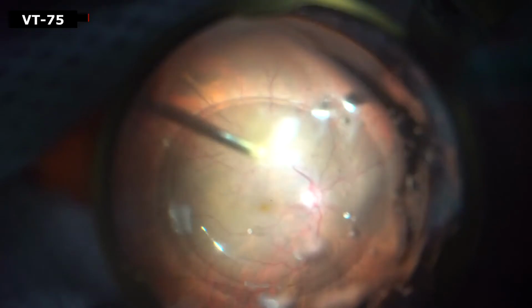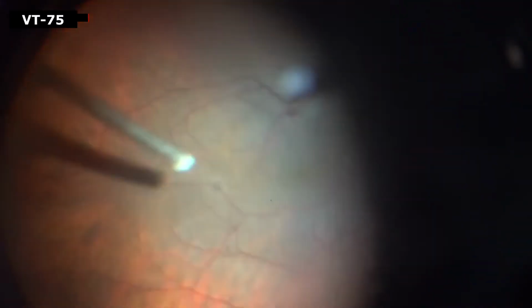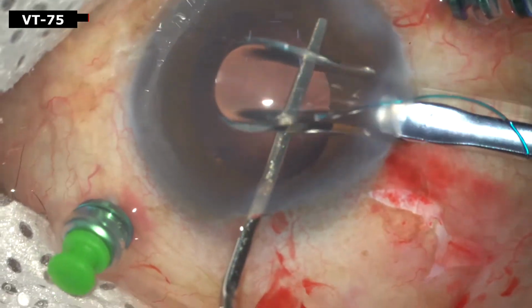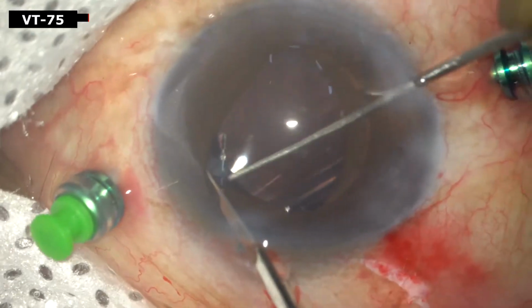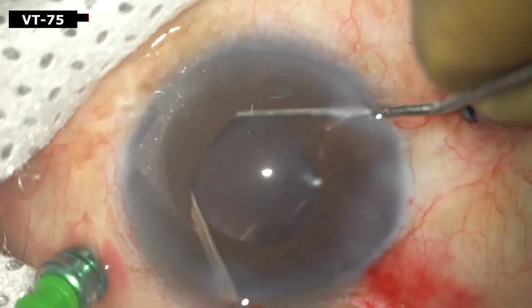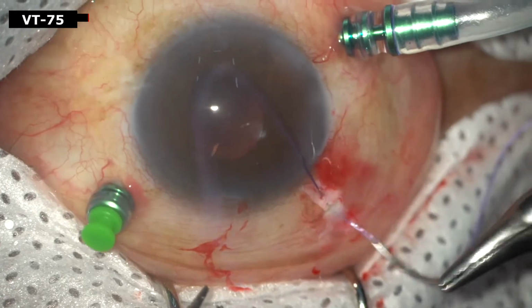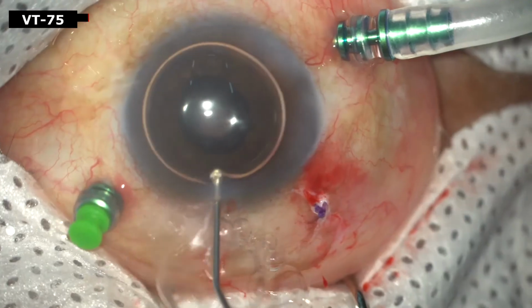Vitrector was used to take care of the smaller pieces. PFCL was aspirated. A 3-piece foldable intraocular lens was placed in the sulcus. The sclerotomy site was sutured and the case closed.